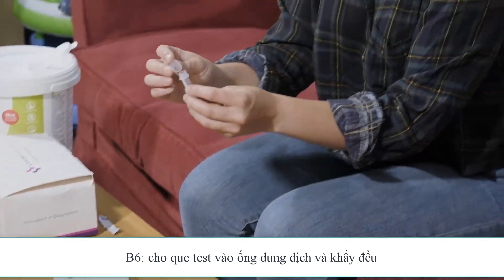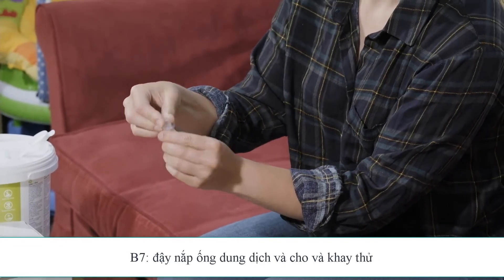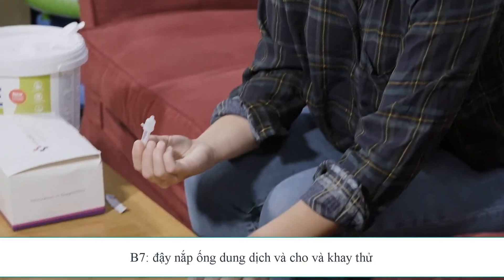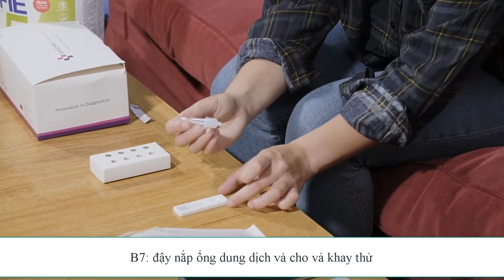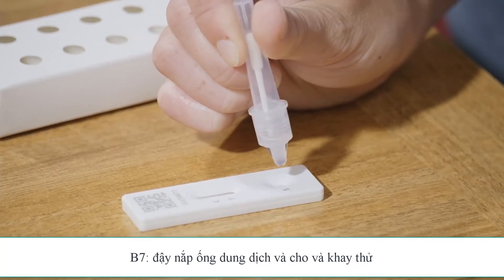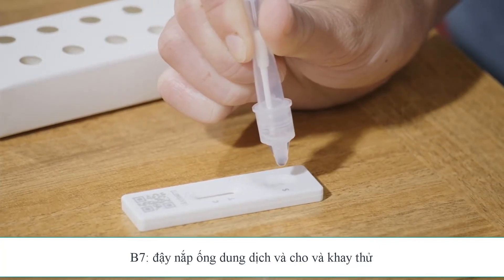Take the extraction tube and secure the attached nozzle to the top firmly. When you're happy that it is secure, hold the dropper vertically and apply three drops from the extraction tube into the well labeled S on the cartridge.